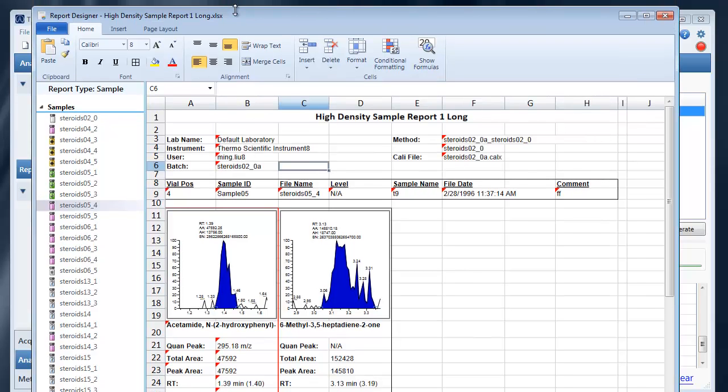Up at the top you'll see the ribbon and this will look very familiar to Excel.